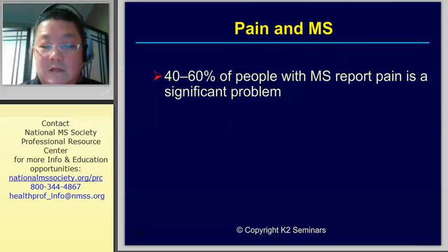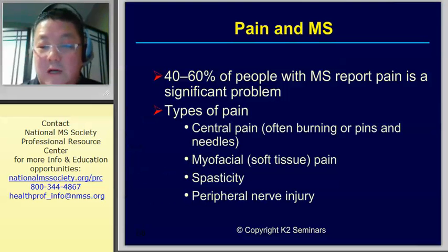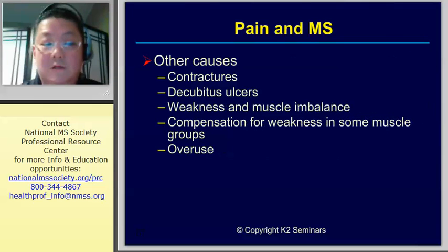So how does it work if you're using a two-channel piece of the puzzle? You can certainly get an outcome that way. Notice that the electrodes have a slightly different position. These electrodes might have to be larger in order to accommodate the area you're trying to treat.